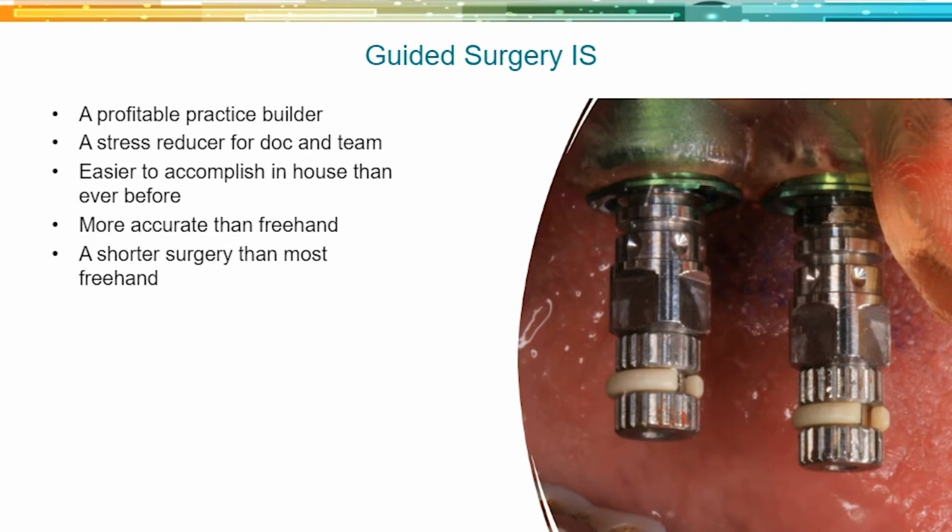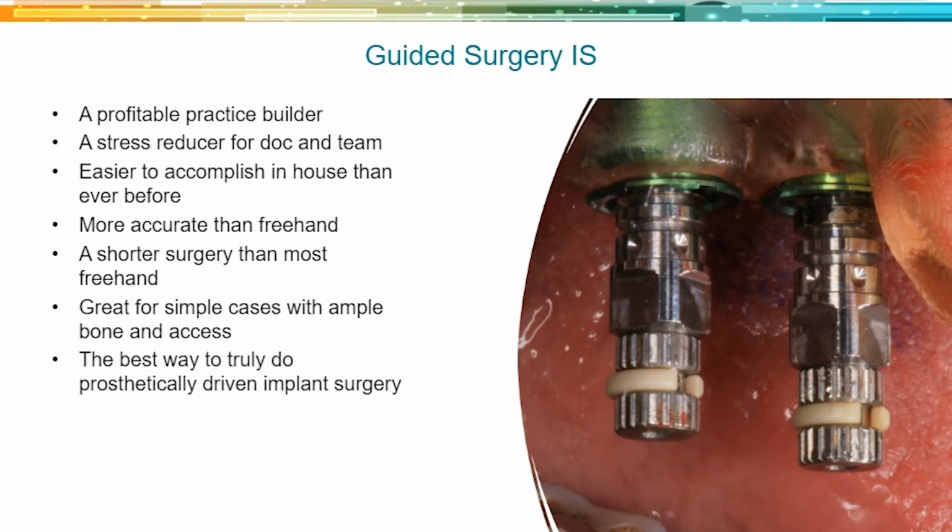Okay, I think it's fantastic for simple cases with ample bone and good access. So if the patient can open wide, you can fit the drills in there. We're not trying to thread the needle. I think it's a great adjunct for simple cases with ample bone. And I think it's also probably the only and best way to really do prosthetically driven implant surgery. We get a digital wax up or have some sort of model that we can import into our software, or the lab does, and now we can put a guide that's going to put us right in the right position. So when it comes to prosthetically driven treatment planning, a guide is a no-brainer.